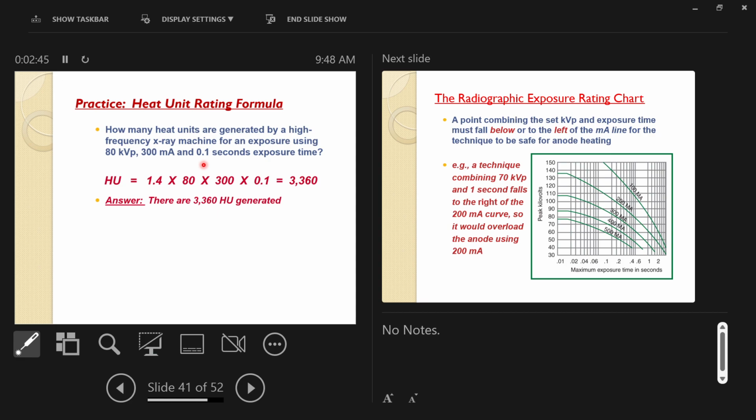By the way, how much mAs is that? What's the mAs number? If it was for 1 second, it would be 300. mAs, not mA. Remember, I will do this in Principles of Exposure. We'll explicitly do a bunch of mAs calculations, but some of you should know this. Milliamperage times time is mAs, milliampere seconds. Milliamperage is a number telling you how many free electrons are going across the gap, so it tells you how many electrons you have to make X-rays from. More milliamperage equals more electrons equals more X-rays produced.